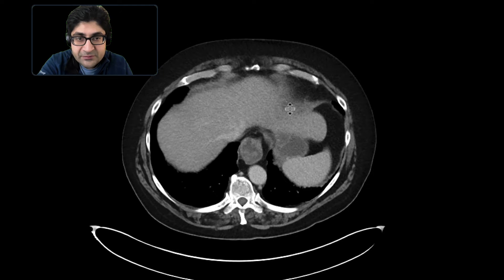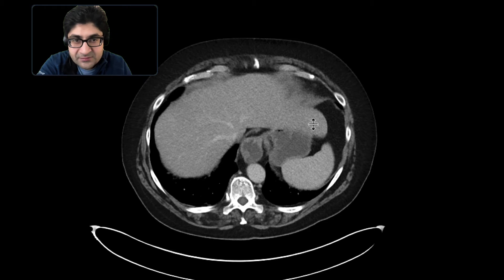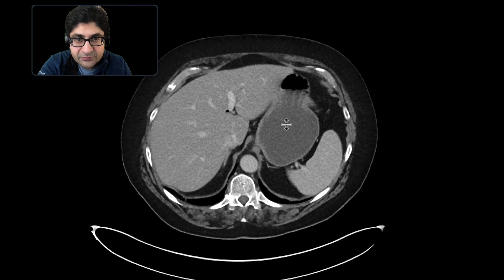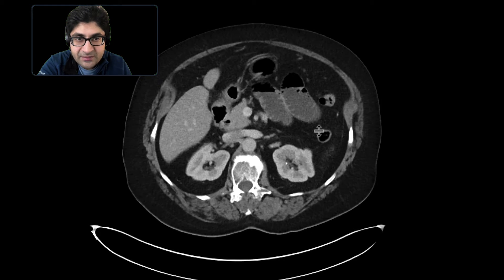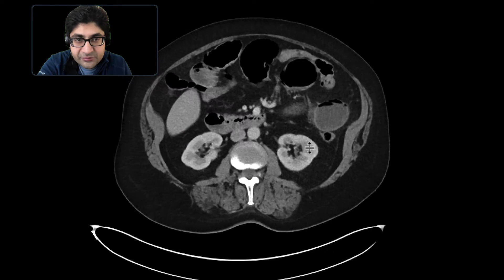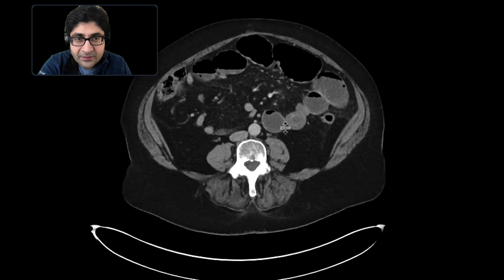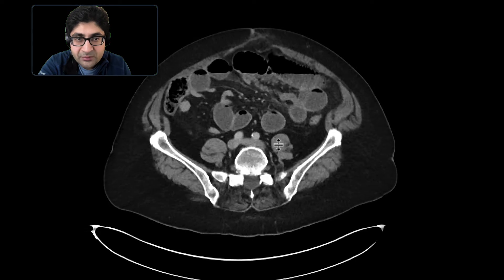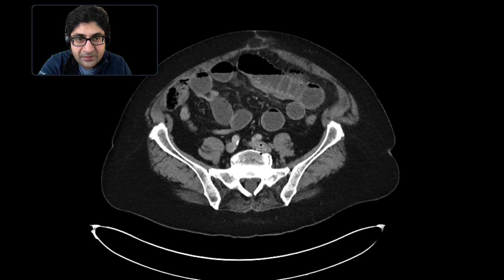The CT was performed with intravenous contrast. You can see immediately that the distal esophagus is distended with fluid. There's fluid in the stomach, which is mildly distended. There are also numerous distended loops of small bowel that contain fluid and air, with some of the distal small bowel collapsed.